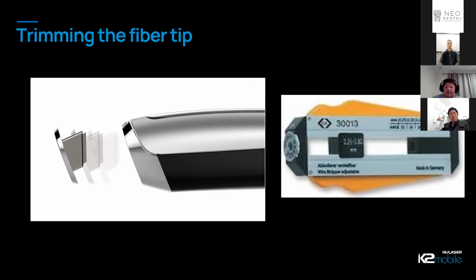You use it to make a little score on the actual fiber, like a little line, and then you break off the unwanted portion, and then you have a brand new tip. The manual's got obviously a detailed instructional diagram on how to do it, but I'll try and show you as a demonstration at the end as well. There's also a little stripping tool, which is the little tool on the right hand side that you use to remove the protective cladding around the actual fiber optic tip as you keep using it more and more.